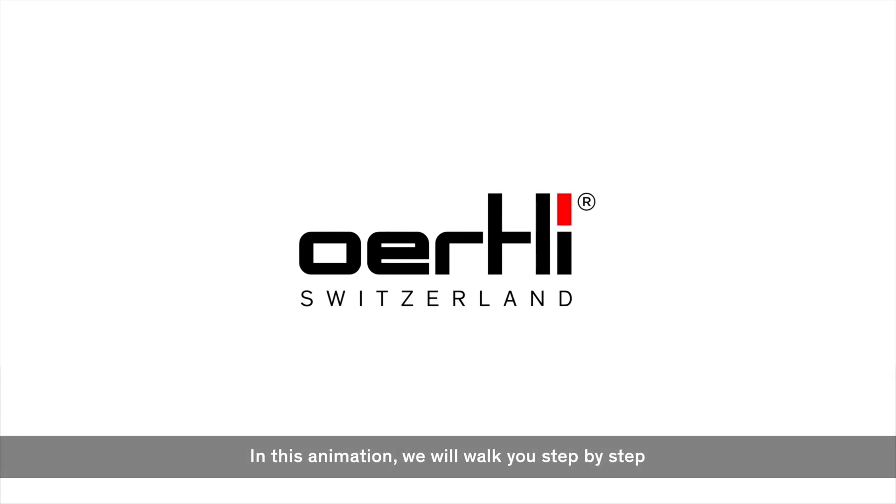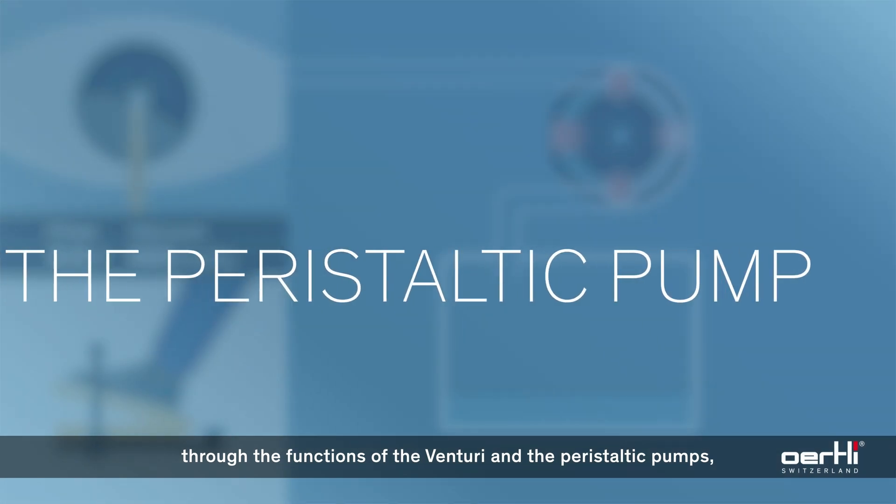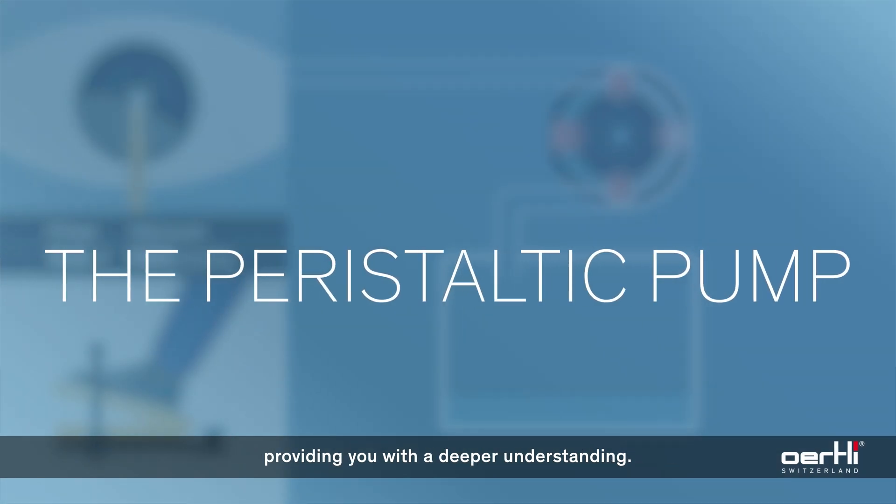In this animation, we will walk you step-by-step through the functions of the Venturi and the peristaltic pumps, providing you with a deeper understanding.